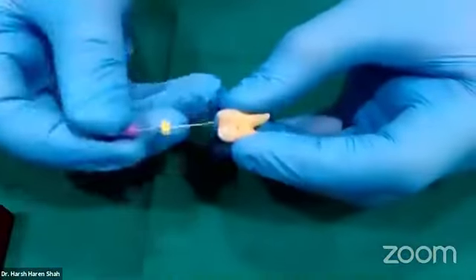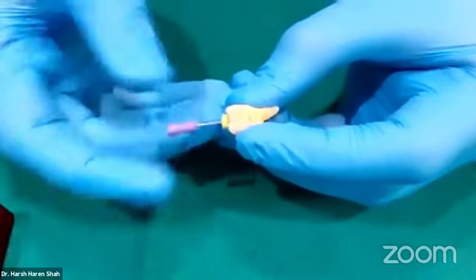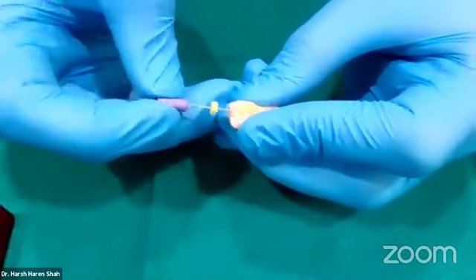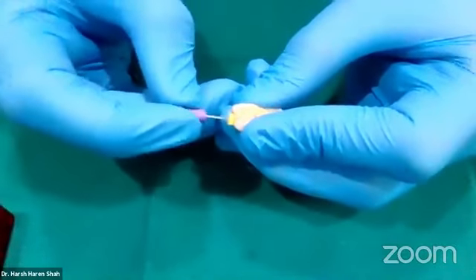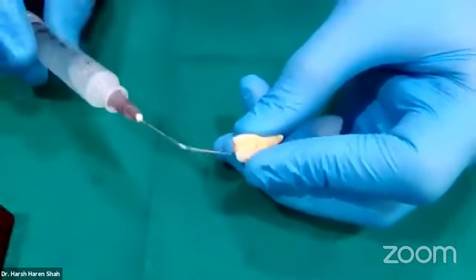The next step after irrigation, like you all know, is going to be recapitulation with the same 10 number K file. So you go till the complete length of 15 millimeters. Once or twice, you may also choose to go half a millimeter beyond the apex in this case. So once this is done, I will be irrigating one more time. So that's irrigation, recapitulation, and irrigation.